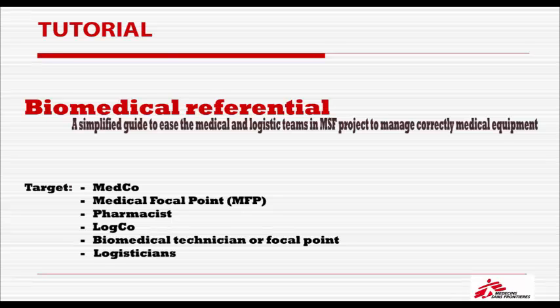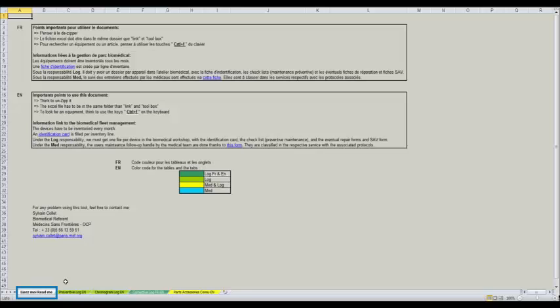This document aims to help any person who is in charge of the management of medical equipment, like the med coordinator, medical focal point, pharmacist, log coordinator, biomedical technician or focal point, or logisticians in charge of the preventive maintenance of these devices. First of all, take time to read the first section called Read Me. Then, the referential is divided into 4 worksheets.